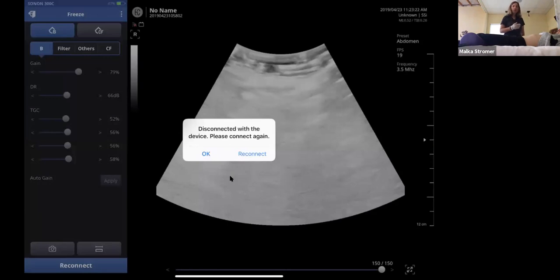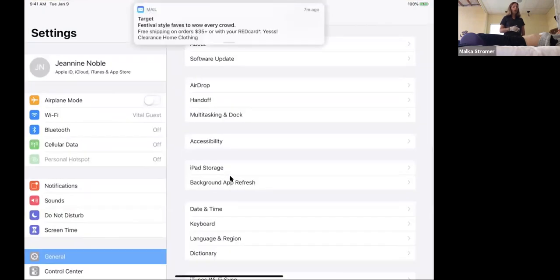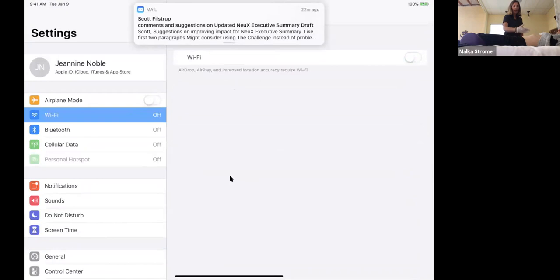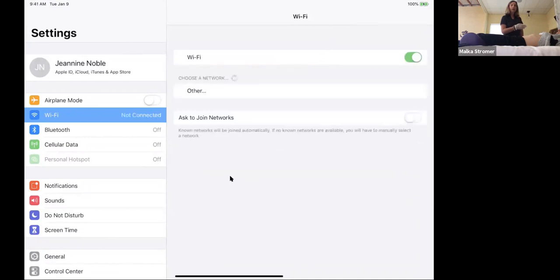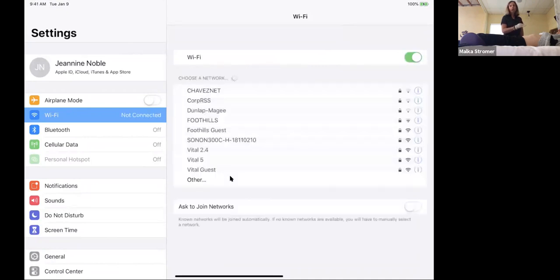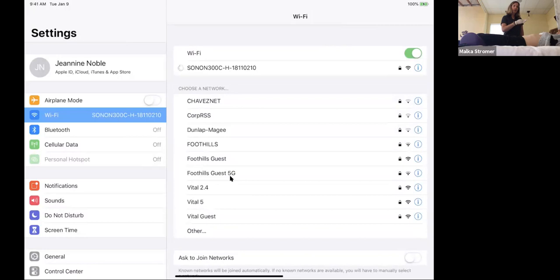Okay, so as you can see, our patient here is in a supine position. Most likely in the emergency room, you're going to have your patient in a supine position. What we're going to be doing is putting our transducer in the midline of the abdomen. Then we can angle the transducer either to the right or to the left. As we know anatomically, the inferior vena cava lies slightly to the right of midline. The abdominal aorta lies slightly to the left of midline. So we're going to do that assessment and look to the right and look to the left to see if we're on the correct vessel.